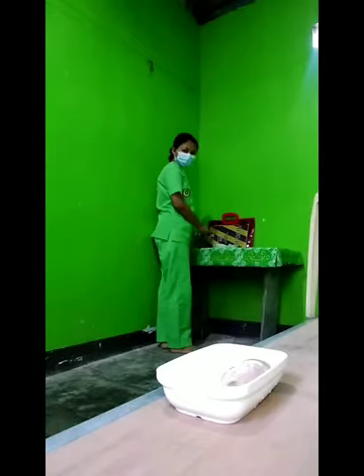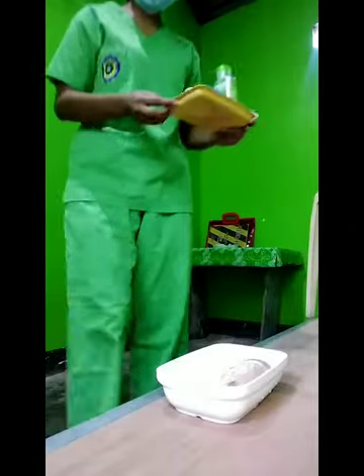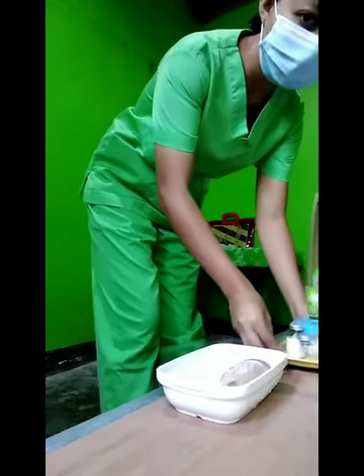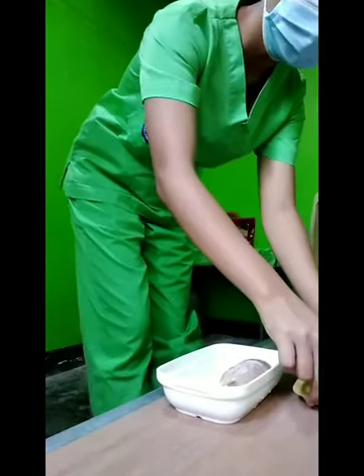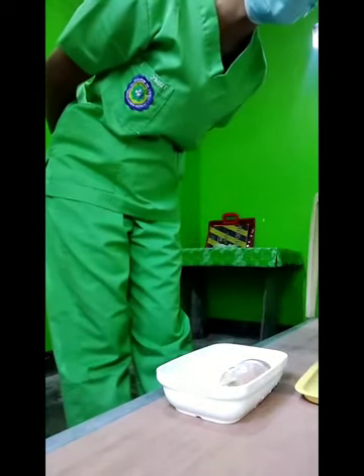Then, transport the medication to the patient's bedside. Ensure that the patient receives the medication at the correct time.